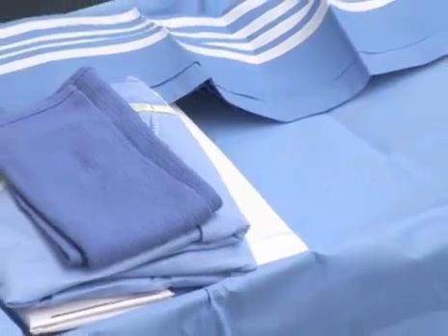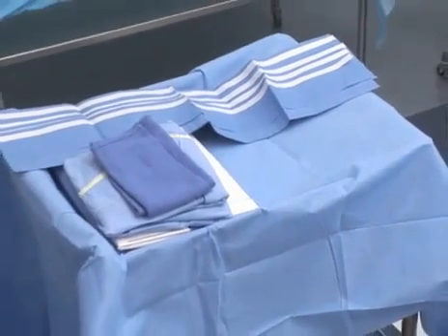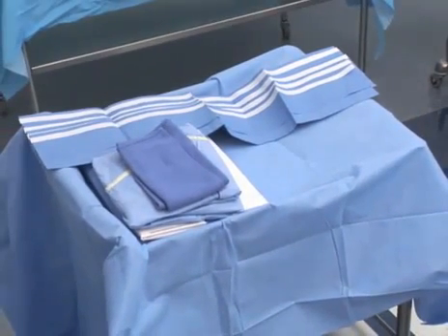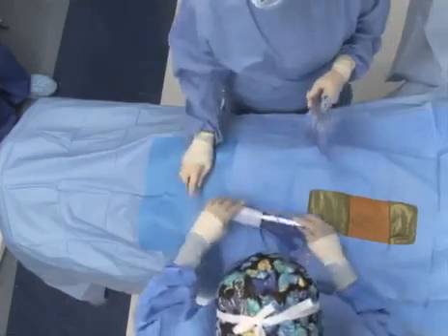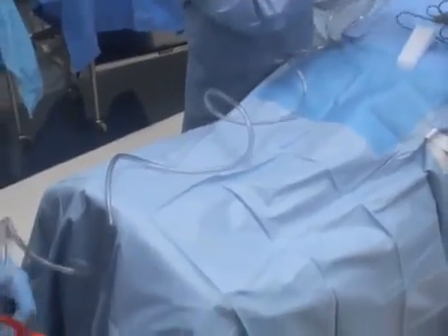Verify the surgeon's procedure at the start of the case and stack drapes on the back table in reverse order of application. Have extra sterile towels and sheets available. Once the patient is draped, the bovie and suction ends are passed off the field so the circulator can connect them for use.